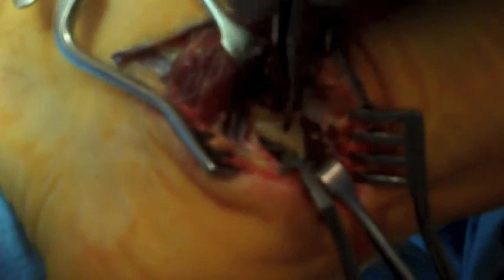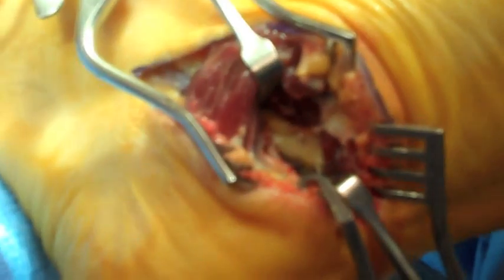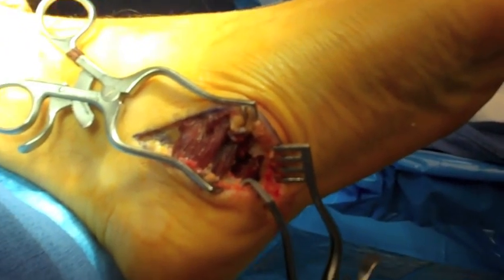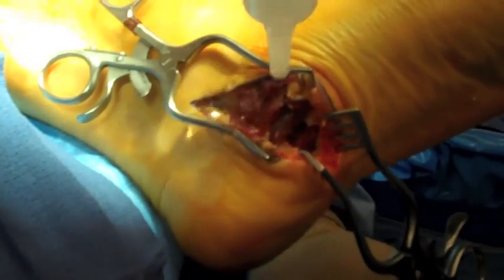Digital inspection of the area is used to ensure that there are no constricting tissue about the nerve as it courses from the medial to the plantar surface of the foot. This is part one of two videos.